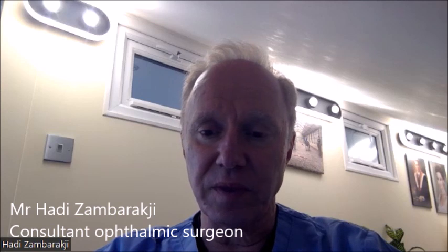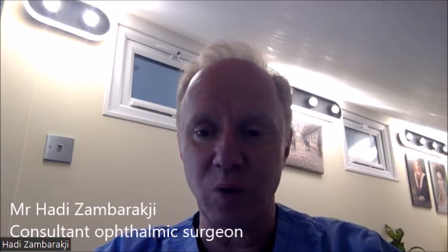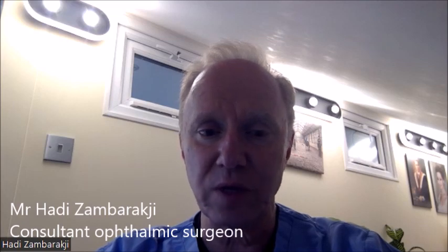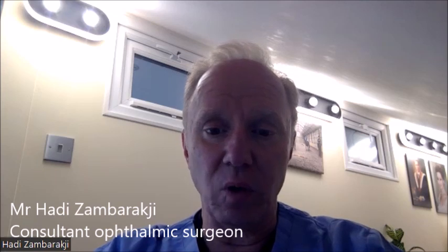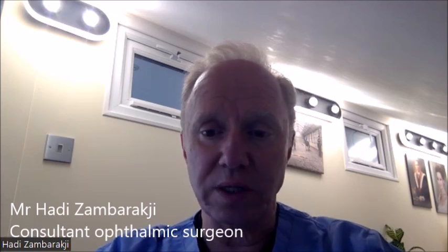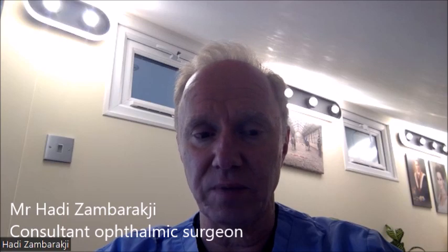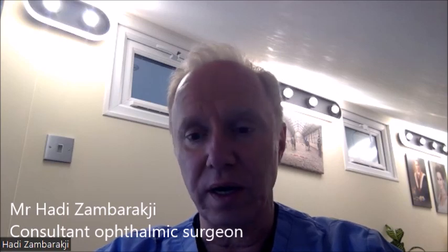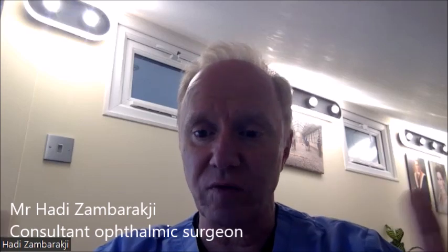And there is a process called neuroadaptation, whereby patients often adapt quite well to these multifocal lenses and adjust to them quite easily. Although there will always be the occasional patient who will simply not tolerate a multifocal lens, and in some scenarios, the patient may even come seeking an opinion with regards to lens explantation. So the patient will come and say, I can't tolerate that lens, I can't drive at night, I can't function in the dark, I need you to take the lens out for me.